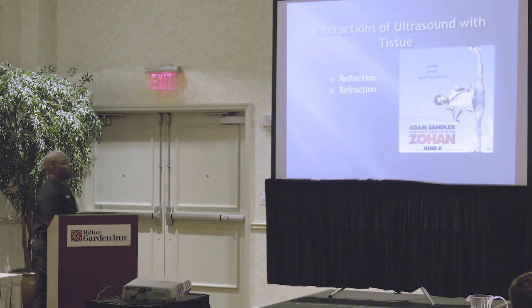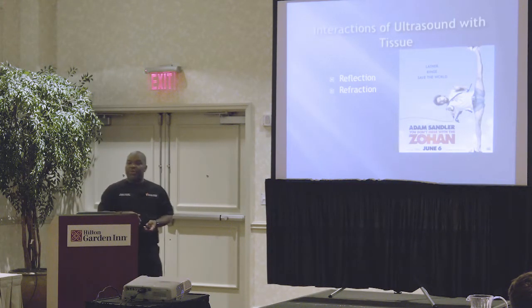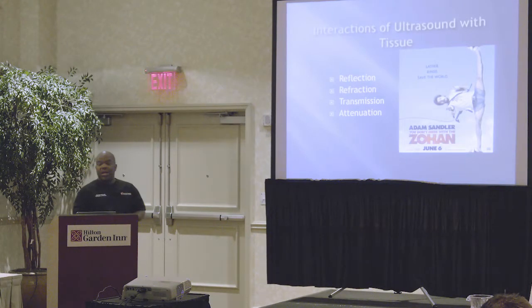Next one is gonna be refraction, and that's actually the bending of the sound as you go through different mediums, all right? The next thing is gonna be transmission, and then finally, attenuation. Attenuation is the one that's gonna bother you the most. This basically tells you that the strength of the sound is gonna be lost depending on how deep one has to go, all right?